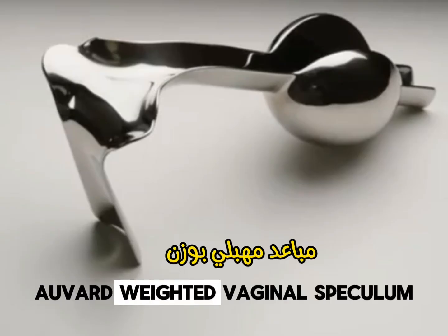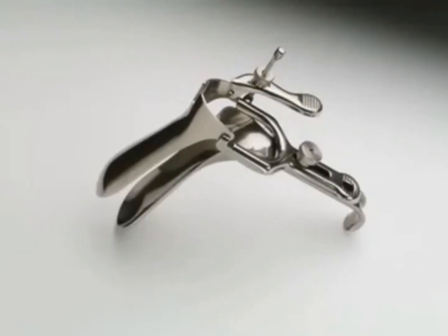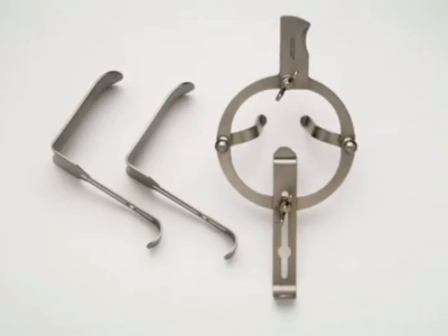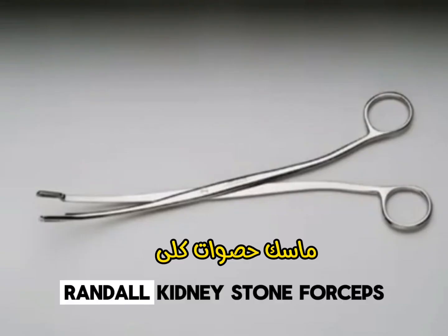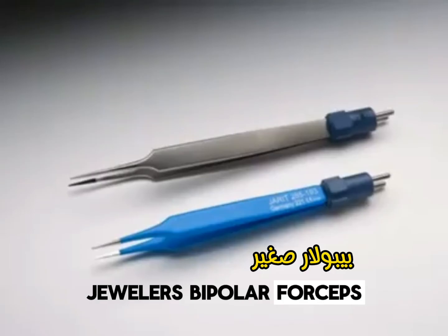Avard Weighted Vaginal Speculum. Graves Vaginal Speculum. O'Sullivan O'Connor Retractor. Randall Kidney Stone Forceps. Jewelers Bipolar Forceps.